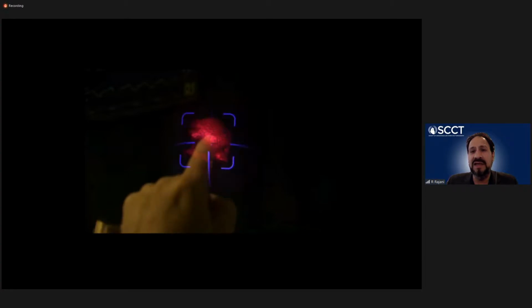So this is a true hologram that was presented in the cardiac cath lab to the interventional cardiologist, whose finger you can see on the image. And he's able to manipulate the CT data set live in the cardiac catheter laboratory to be able to look at the anatomy of the data set before he's actually going to proceed to perform his case.